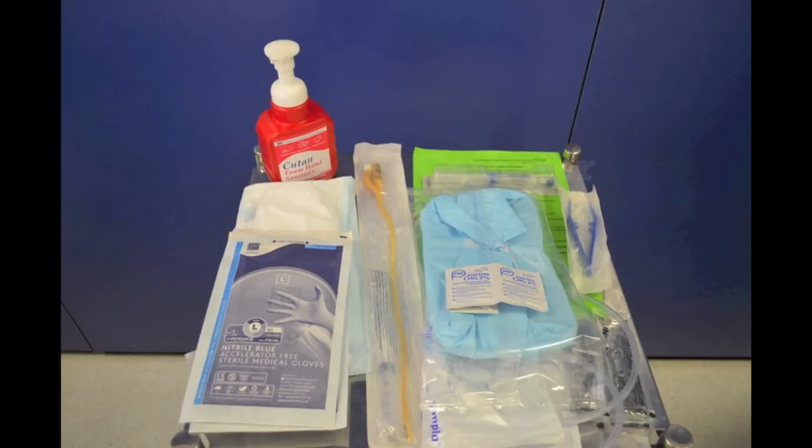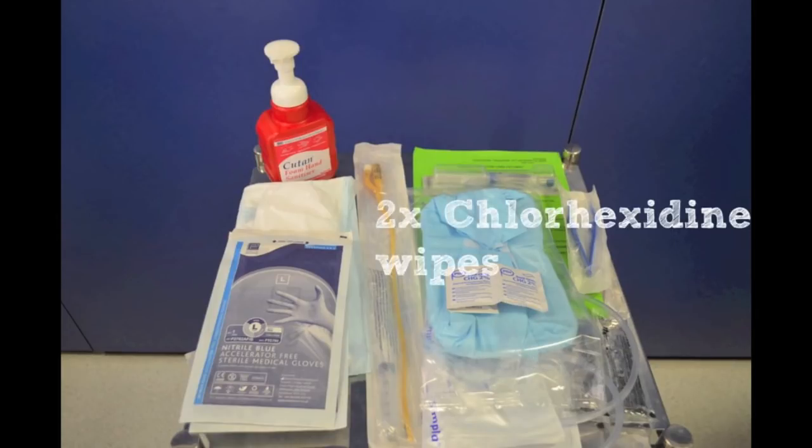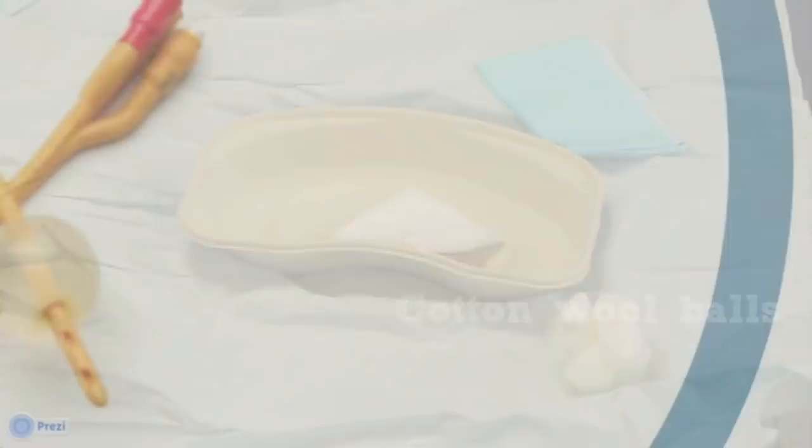forceps, a catheter pack, two sachets of normal saline for cleaning, two chlorhexidine wipes for cleaning the saline sachets, and a catheter drainage bag. The contents of the catheter pack itself are a sterile drape, J tray, sterile swabs, plastic galley pot, and cotton wool balls.